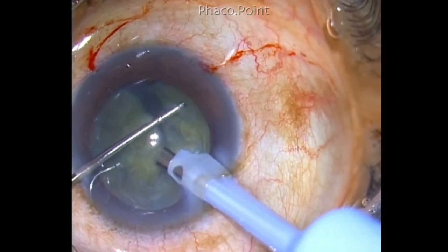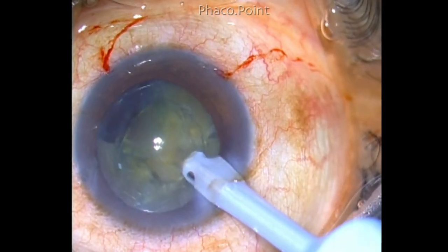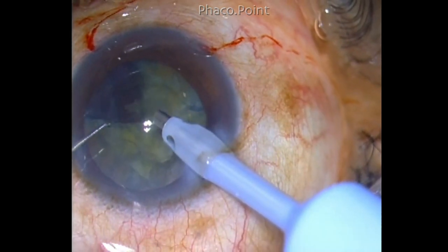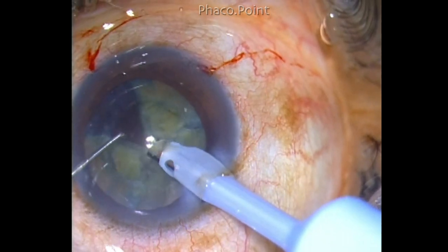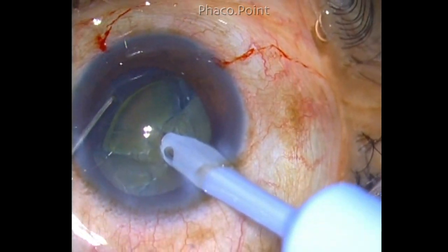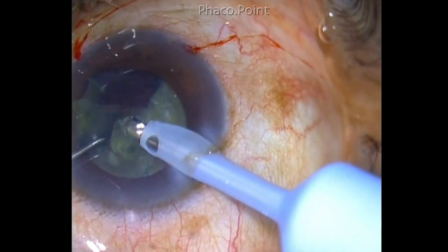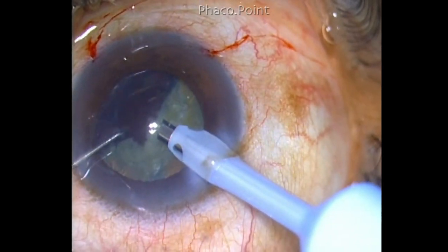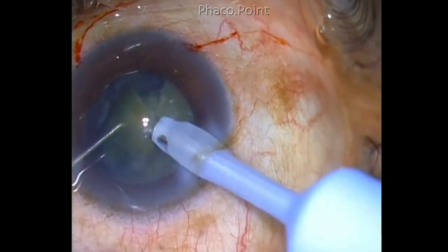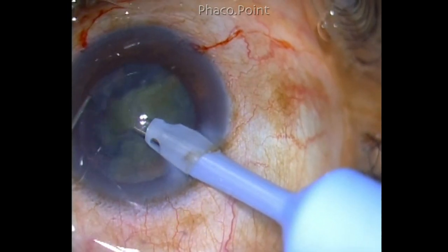Create not just four fragments — create at least six fragments even for a grade two nucleus sclerotic cataract. The reason is the pieces that are mobilized are small. Mobilize only one small fragment at a time, bring it into the central zone, and emulsify it. Ensure that the entire fragment is completely emulsified and there are no small bits left behind before attacking the next fragment. The anterior chamber should be extremely clean and free of any free-floating lens fragments. This ensures that you don't have sharp fragments compacting against the corneal endothelium, which could be a major cause of endothelial damage during phaco emulsification given the strong aspiration flow rate.